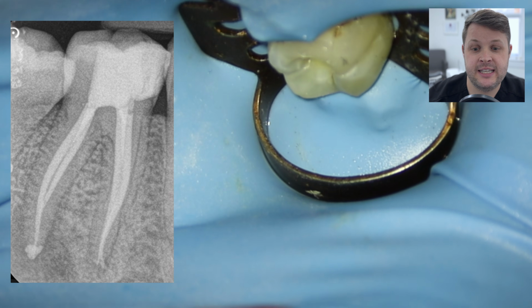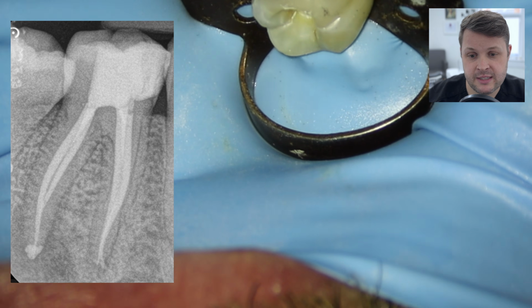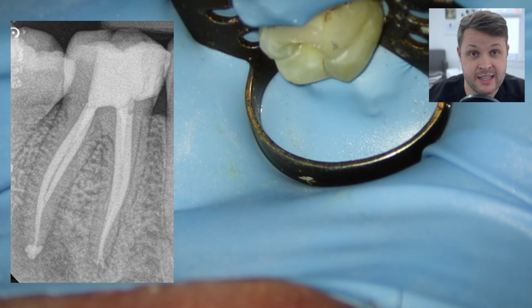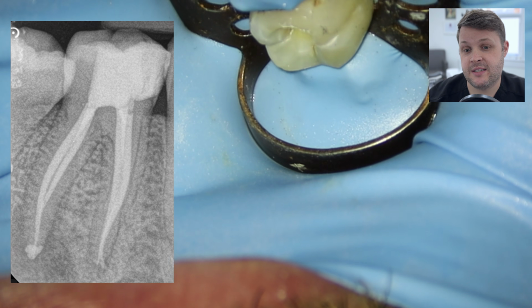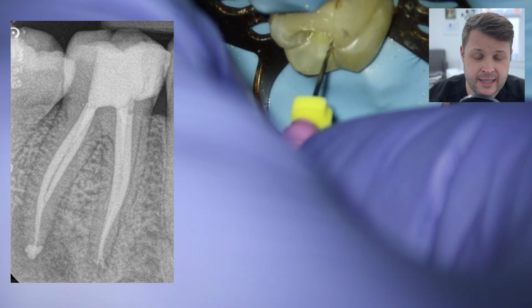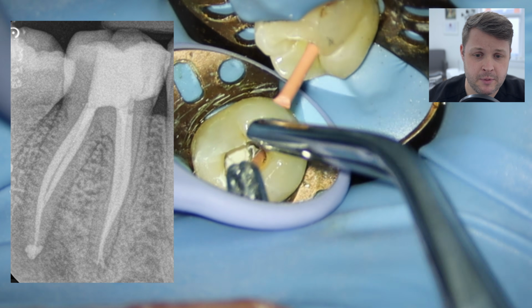I feel like the sealer puff has actually mushroomed around the distal apices. So there's a possibility that there was a high complexity around the end of this tooth. You could argue that this has sealed off the end of the tooth quite well. And overall, again, a really nice result. I'm super happy with this.